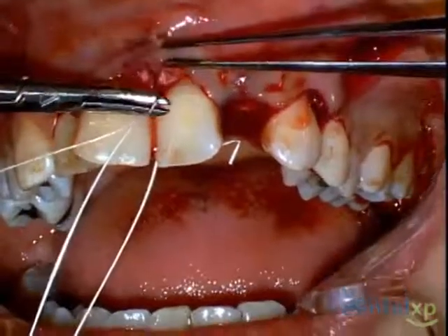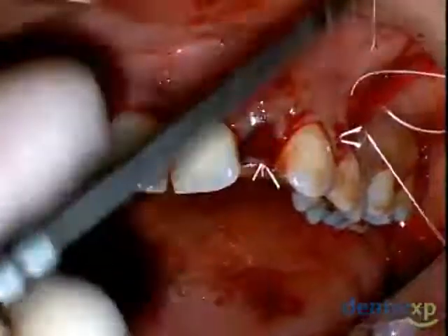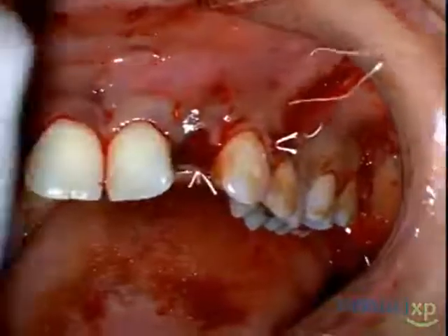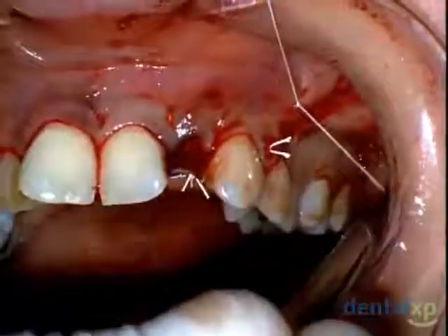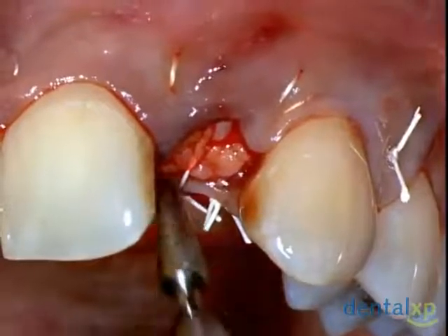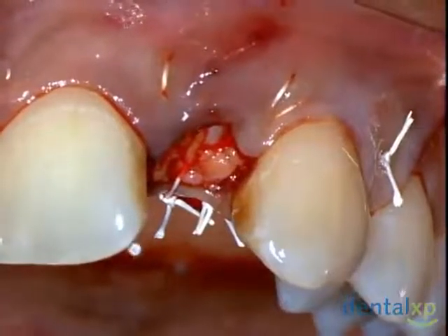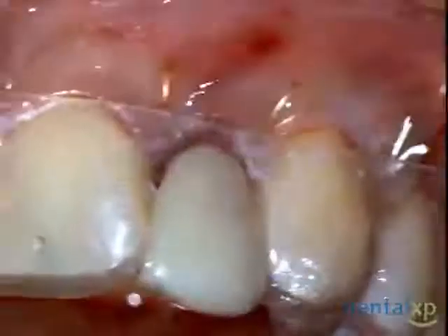We're going to utilize these sutures once again for the interproximal areas between the central incisors to co-opt the last parts of the flap. And then the last thing I like to do is close off the vertical incision. And once again, this is done with a horizontal mattress. Here you can see that because we use connective tissue, we don't have to completely close and coronally position the mucogingival junction, which is quite nice. We've stabilized the connective tissue with the PTFE sutures. And this is excellent for us because therefore we really don't have to alter the dimensions of the defect during the healing phase.